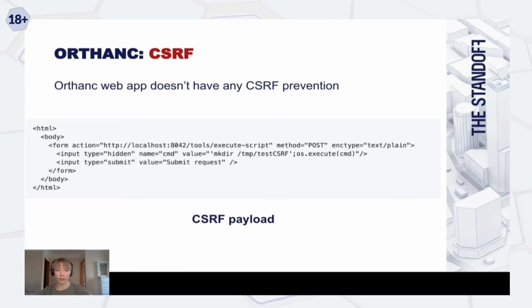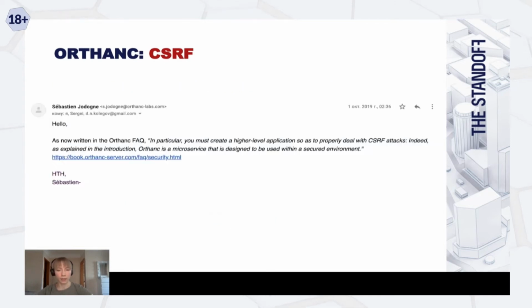But it does not mean that this authentication is not vulnerable to CSRF attack. Here is the example of the code which this page should contain, so that the Orthanc user can actually connect to it later, and there the request would go to the Orthanc server, and the code will run there on the server.